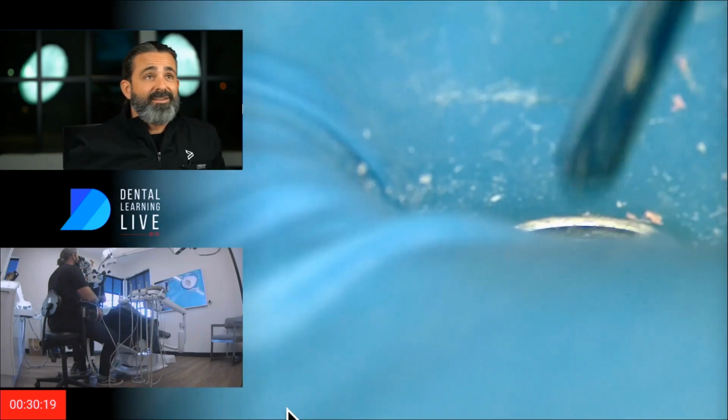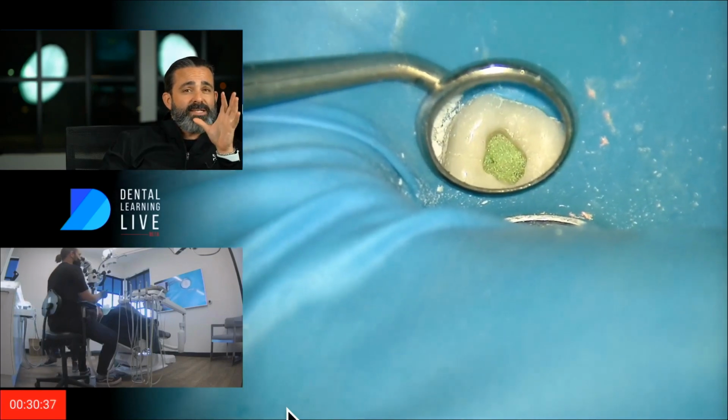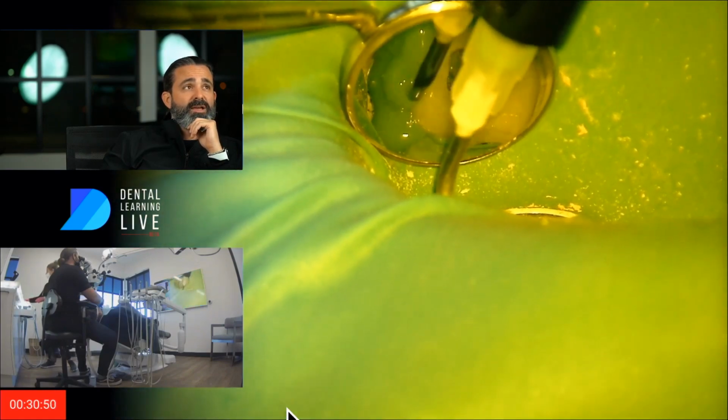Or we've just begun. Done removing the gutta percha, but we've just begun the battle because now I got to remove all the bacteria. Whatever's inside that apical third that caused that rarefaction, now that's the job. I'm employing the GentleWave for that.